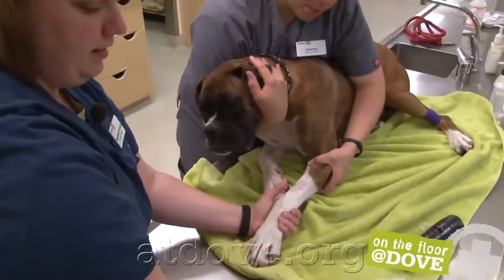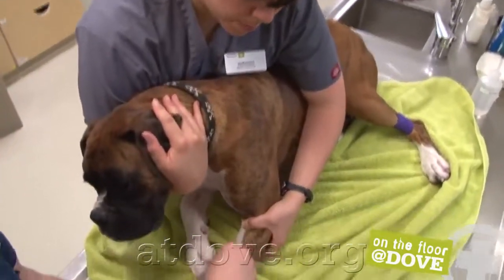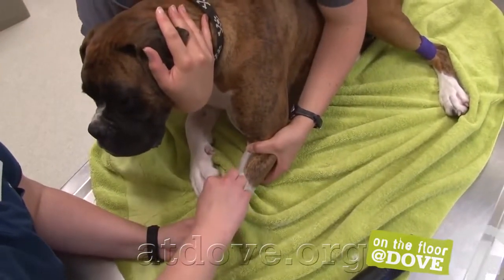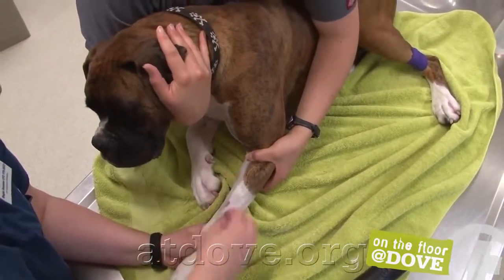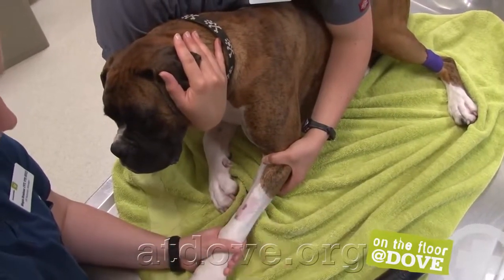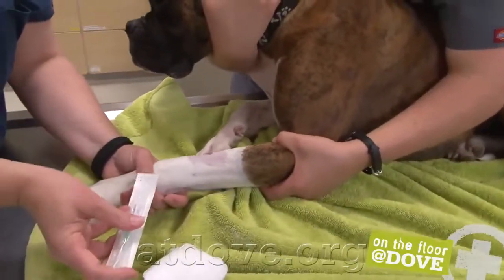Once you've identified the vein, you want to scrub. Again, I like to use cotton balls, a little less trauma to the skin. And I've got some chlorhexidine scrub and alcohol. And I'm going to clean the site at least 3 times with my scrub and alcohol. Just want to make sure that the skin gets clean. If you need to do it 10 times because it's a really dirty dog, there's nothing wrong with that. I like to have some dry gauze available in case I get a little extra bleeding, kind of keep things clean.